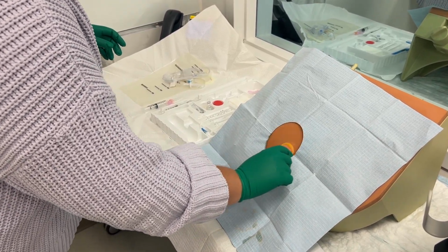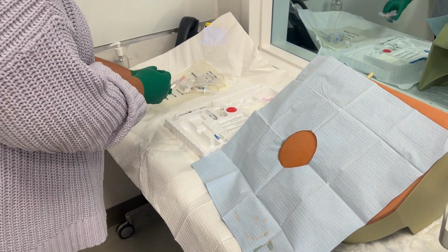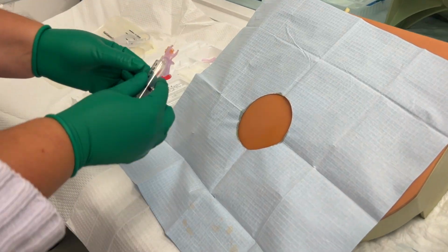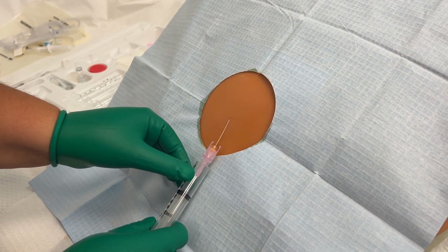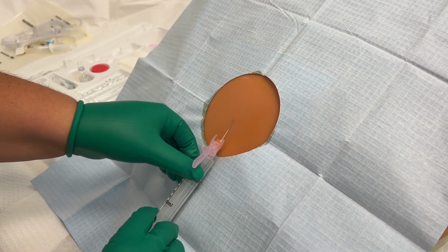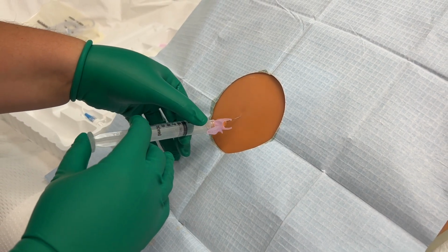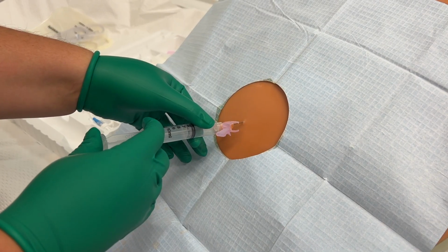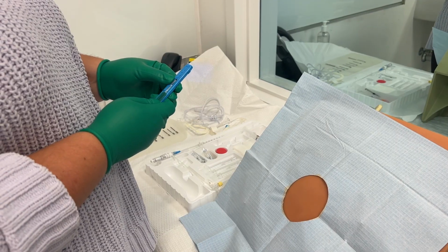We will begin by cleaning the skin after we have created our sterile field. After cleaning the skin, we will start by anesthetizing. First, we'll make a superficial wheal at the surface of the skin. And then we will move the needle deeper into the tract through which the paracentesis needle and catheter will travel.